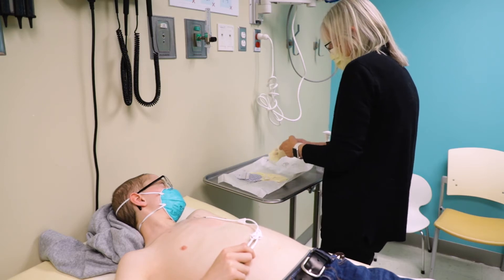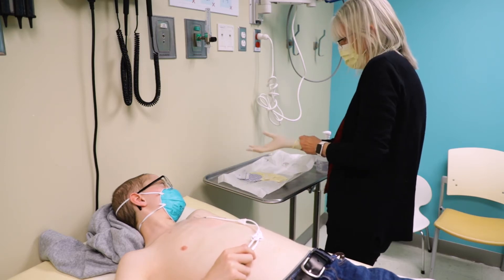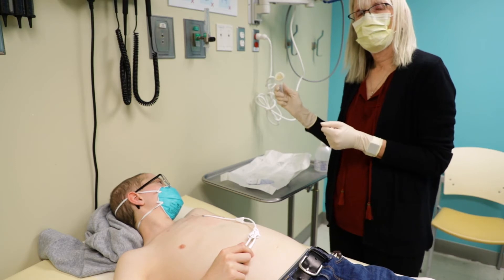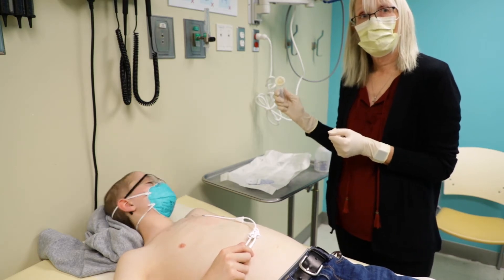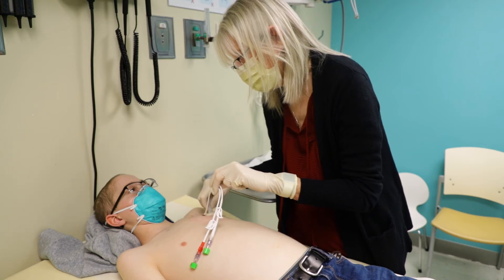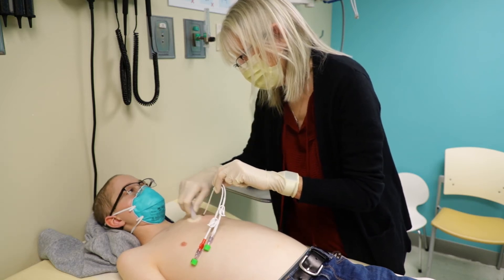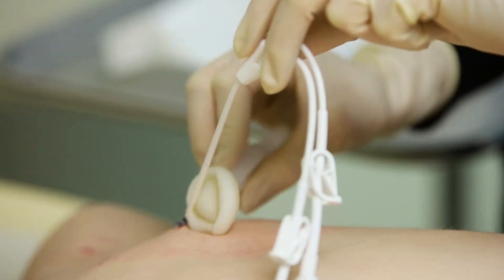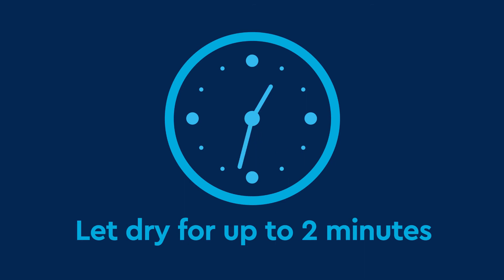Then put on sterile gloves. This is what you use to clean. Squeeze the wings together to activate the chlorhexidine. Clean the central line area for 30 seconds, scrubbing front and back. Make sure to scrub the insertion site and line. Wait for the chlorhexidine to dry — this can take up to 2 minutes.